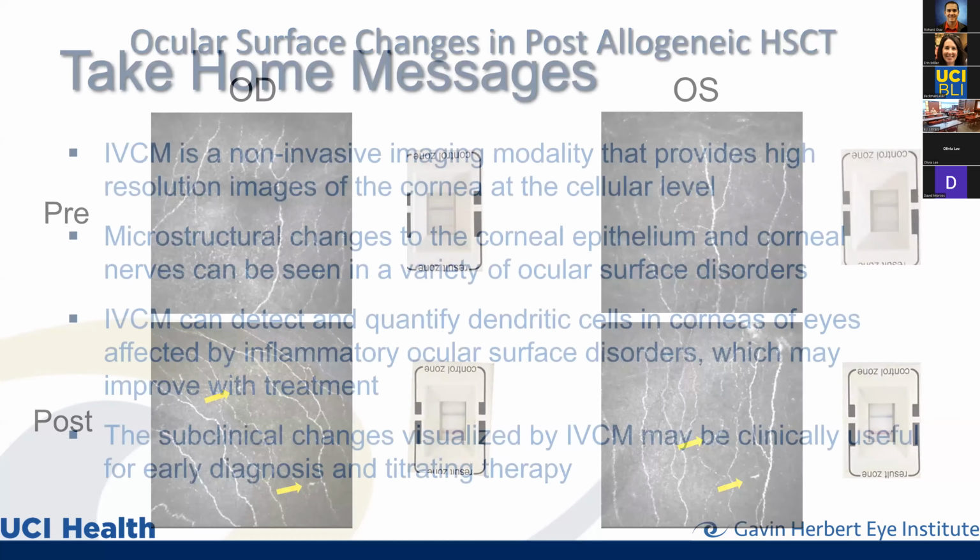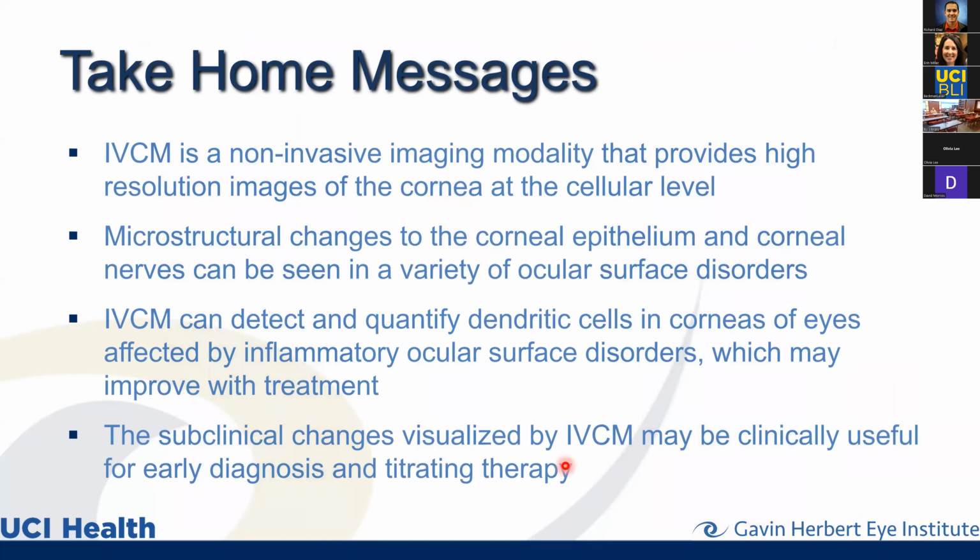So thank you for putting up with me. These are my take-home messages. So confocal microscopy is a non-invasive imaging modality that provides high-resolution images of the cornea at the cellular level with in vivo histology in a non-invasive manner. We can see microstructural, or let's say subclinical, changes to the corneal epithelium, corneal nerves, and these are consistent across a variety of ocular surface diseases that occur from different etiologies.